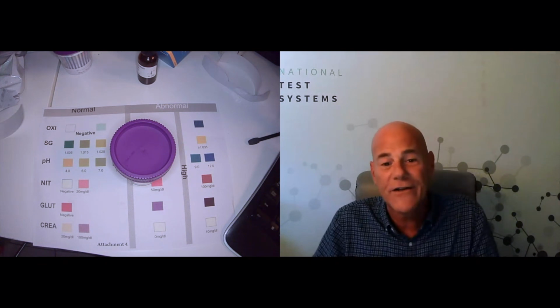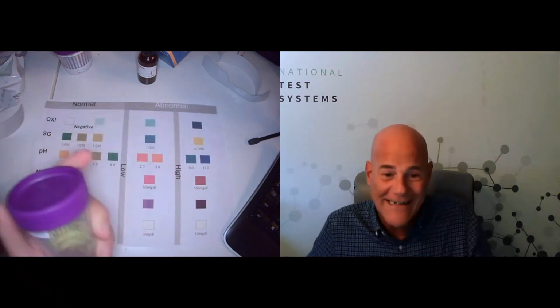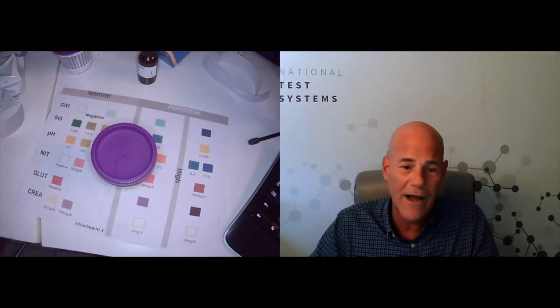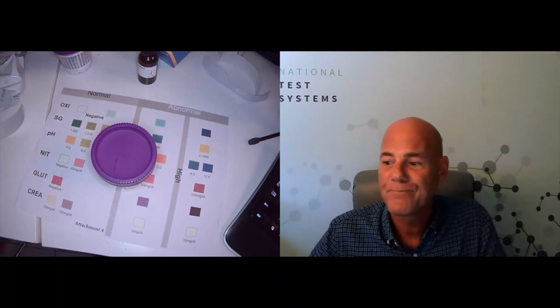get your baselines. Start paying attention to what their specimens look like. And if you're using this cup and you can't find time to look at all 6 adulterants, please at least look at the creatinine value, because that sometimes is enough to tell you whether or not you're testing a valid specimen, and it could explain why you did or did not get the result that you were hoping to get.